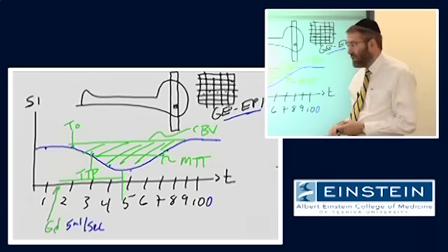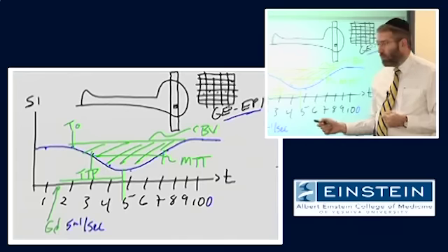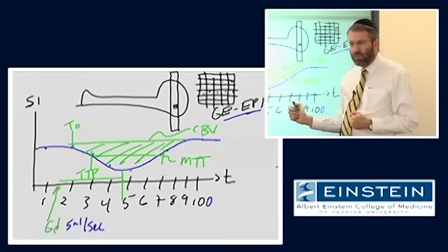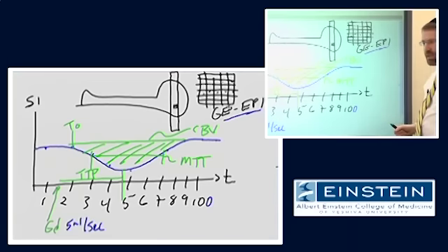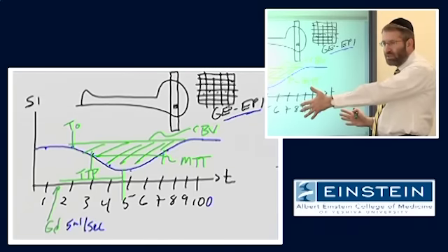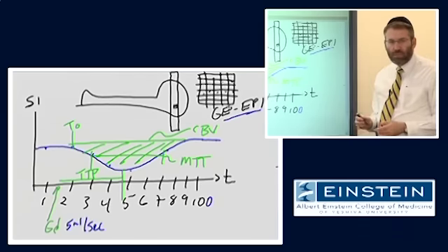If you're interested in stroke, things that tell us about the timing of the bolus are much more important. So things like the time to peak or the mean transit time are the parameters we'll look at. But basically, by giving a contrast injection and watching for a relatively brief period of time, this entire process happens in well under 2 minutes. Might be less than a minute, depending on how you want to do it. You can derive all of this information. All right, any questions about this?